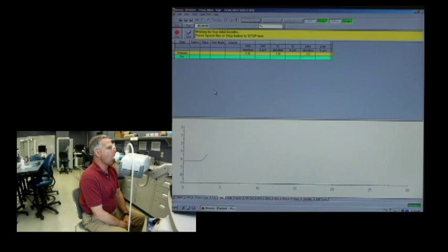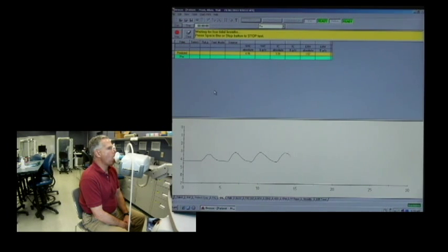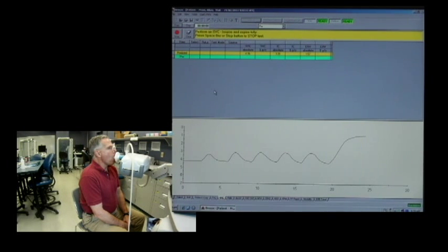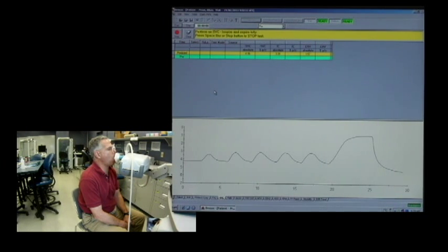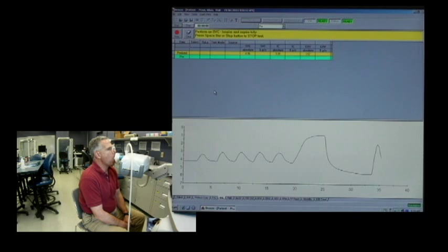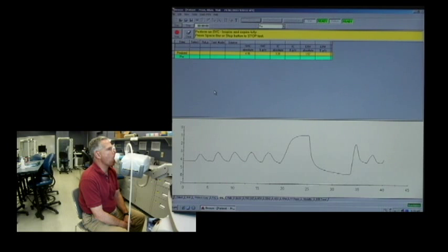We get the patient set up with just nice, easy breathing. You can see in the graphs that inspiration goes up and exhalation goes down. We let him establish a nice baseline, then coach: big breath in, as big as you can — big, big, big, come on, hold it — and blow it out, keep blowing, keep blowing it all out. Then a nice big breath in and relax. That completes our first slow vital capacity maneuver.